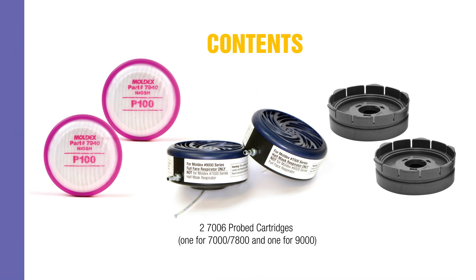Kit contents: 2 7006 Probed Cartridges — 1 for the 7000 and 7800 series, and 1 for the 9000 series. 1 pair of 7940 P100 Filter Discs. 1 pair of 7920 Filter Disc Piggyback Adapters.